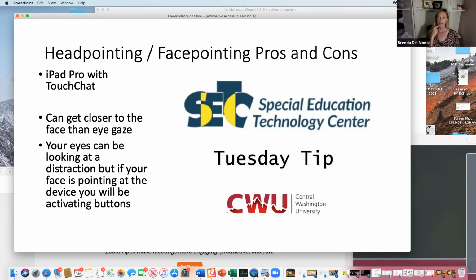So there was that. That was like a whole thing. But not that many kids are on it, but still the kids that were, they couldn't access communication while they had their mask on. But anyways, it takes those points. The good, the bad, and the ugly of taking the points of your face is your eyeballs could be looking anywhere. So basically you're facing the iPad, and then if somebody walks in the door and you look at them, but you don't move your head away from the screen, your nose and those 5 points it's taking from your mouth, your nose, and your eyes could be activating other buttons.